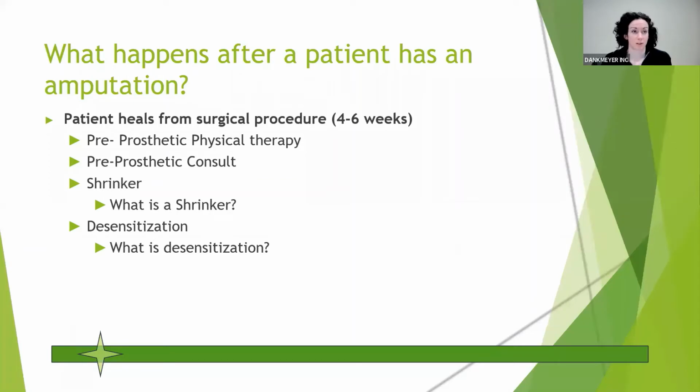if it's below, usually for your transtibials or below the knee amputees, it provides some knee extension, which is nice to keep reduce the risk of flexion contractures. But then it also just provides that distal end protection for falls. We see it very rarely with the transfemorals, the above knee, just because it is more bulky and difficult to keep on, where those shrinker socks usually work just better for that population.